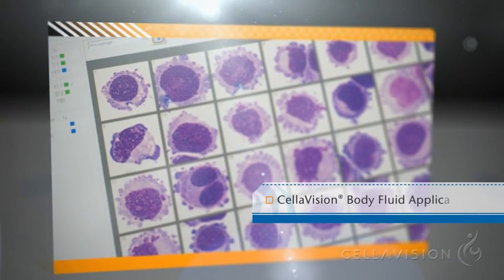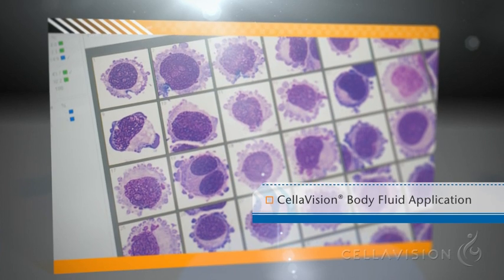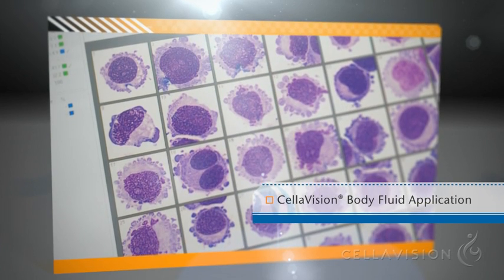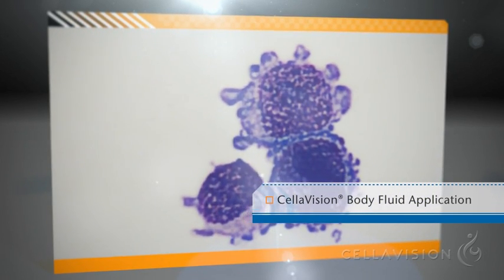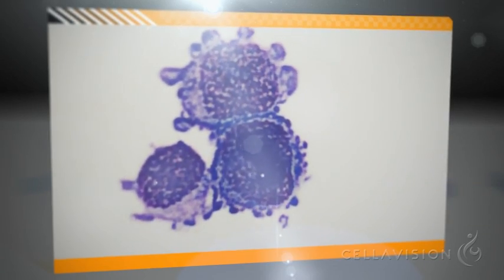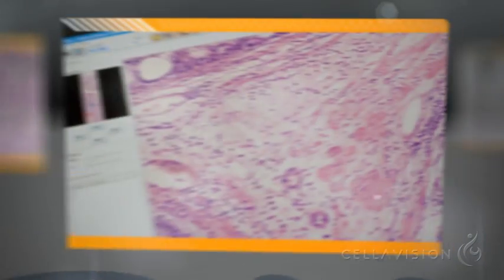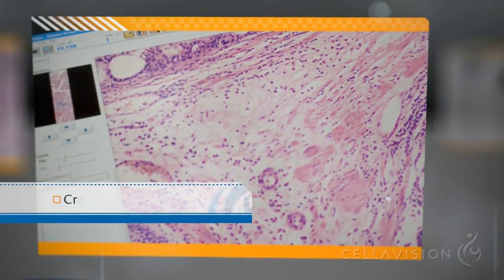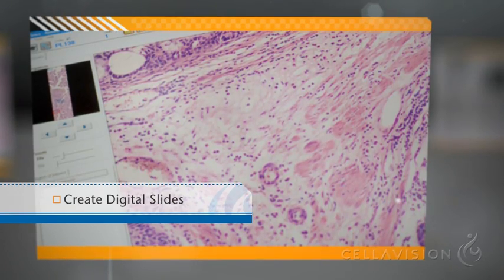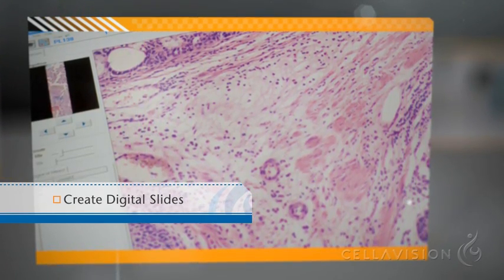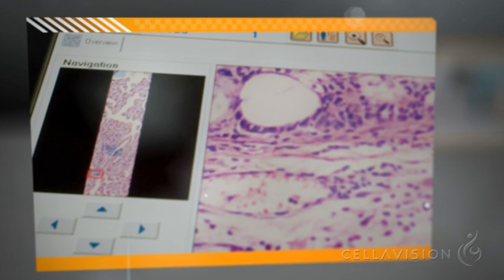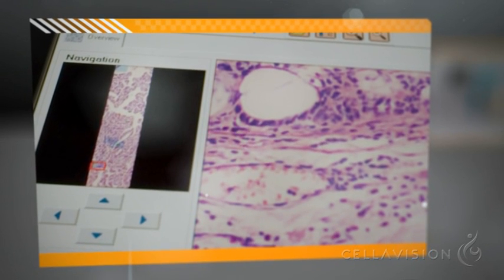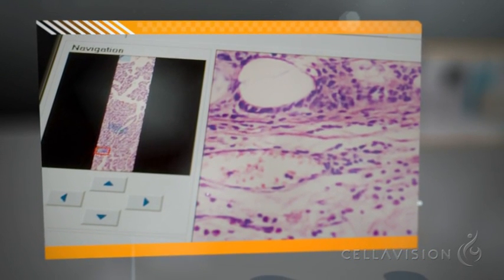The Cellavision body fluid application automatically performs a preliminary differential of nucleated cells and allows the user to digitize the entire sample area. For research and educational purposes, it is possible to capture digital images of custom defined areas of any interesting specimen, creating a digital slide.